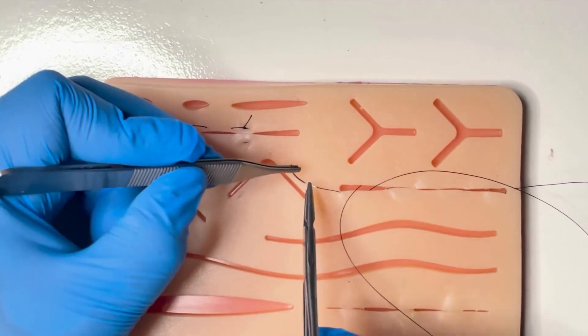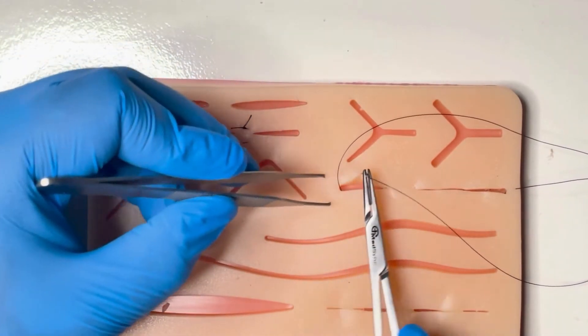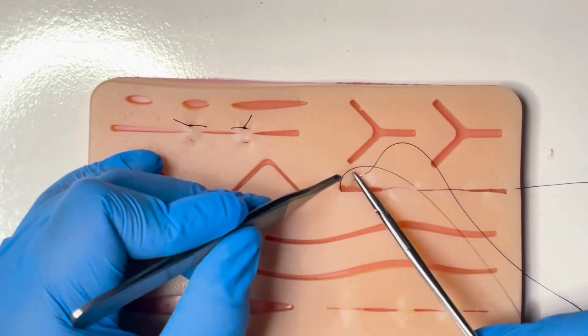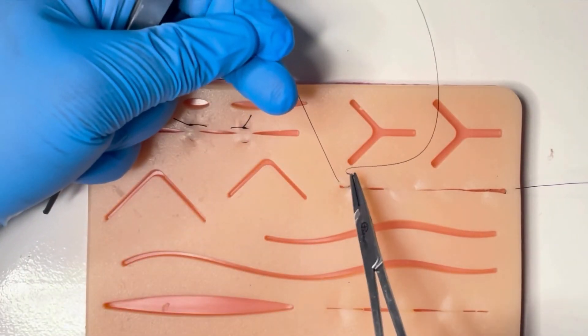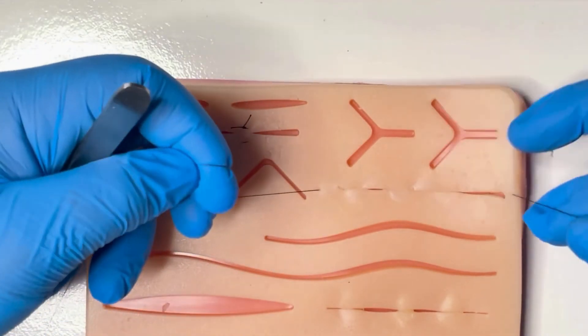Here we are demonstrating a pull-through subcuticular. For this you use a monofilament non-dissolvable suture and remove it once the wound is healed. You can also use a dissolvable suture and bury the knot at the start and at the end of the wound.